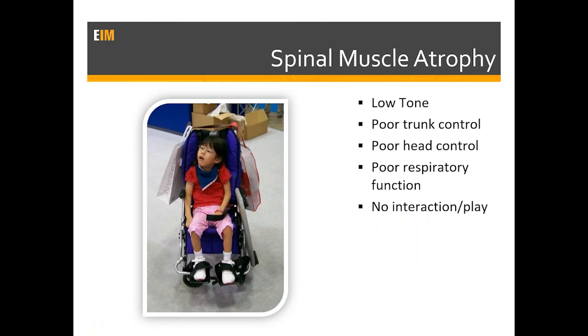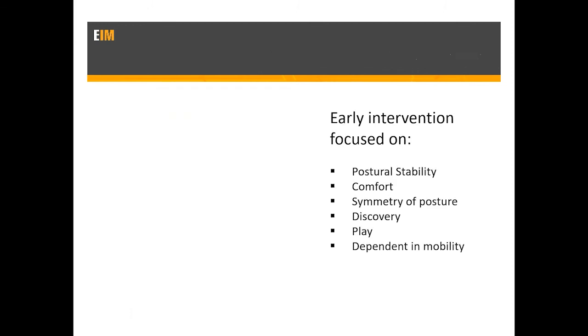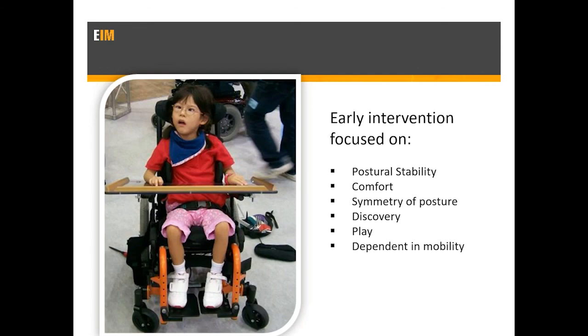And then last one, we have this young little lady using an umbrella stroller as not only her mobility, but also as the shopping cart, and found that she just got sort of left in the corner and really wasn't included. We're creating a lot of kyphosis, really having trouble with management of secretions, with management of head control, all those things. And I guess we hopefully at this point know that we're going to put her in a dynamic tilt and space chair, right? We want to have some nice postural support.